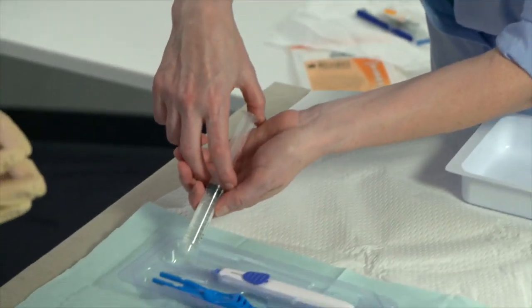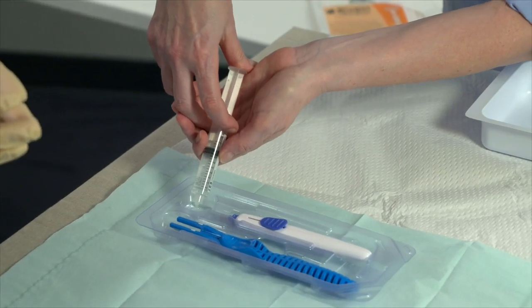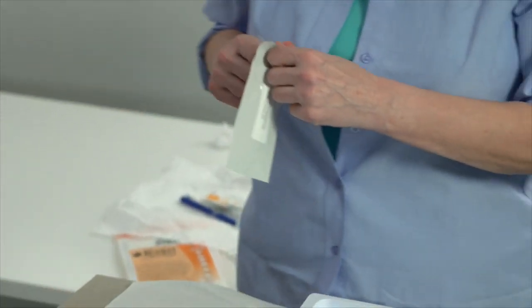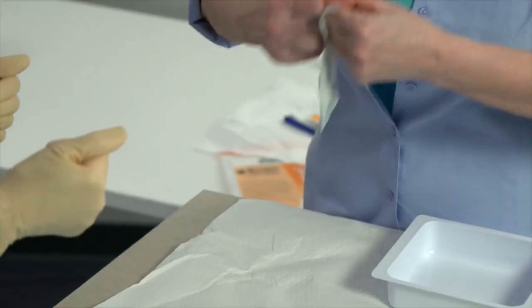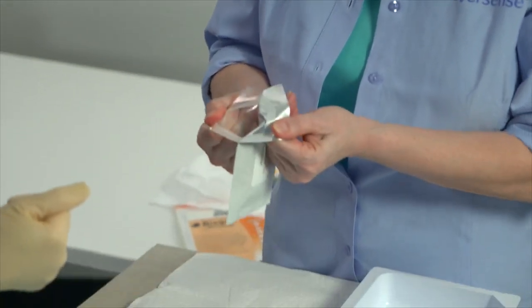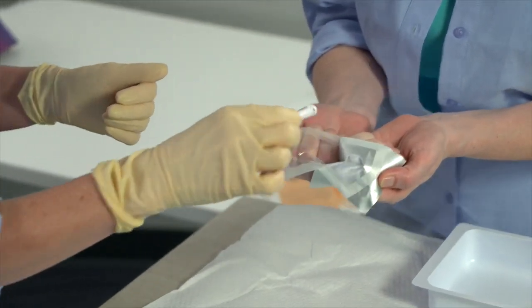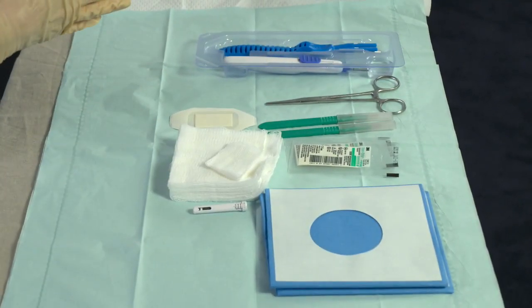Have your assistant add 10 milliliters of sterile saline solution to the preformed well in the sterile inner tool tray. Your assistant should stand close while not compromising the sterile field and open the pouch containing the sensor holder. Grasp the sensor holder from the wrapper and place it in the sterile field, being careful not to touch the outside of the pouch.